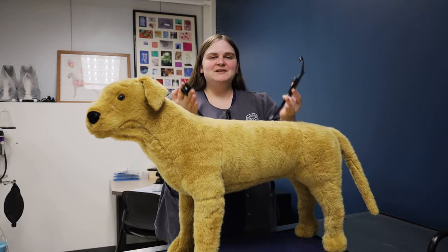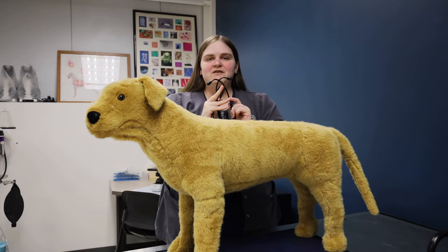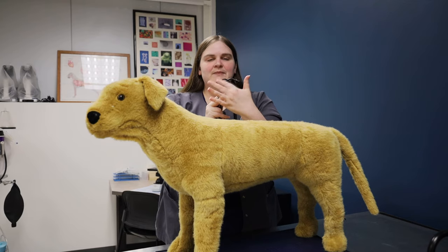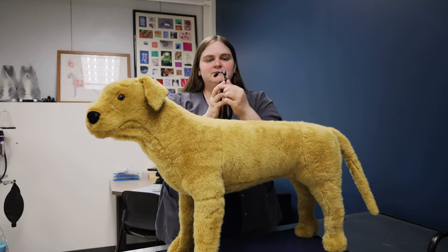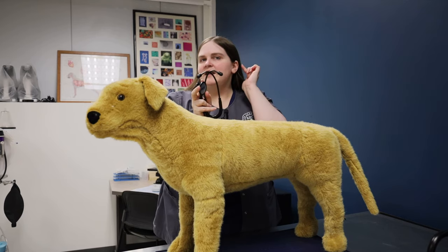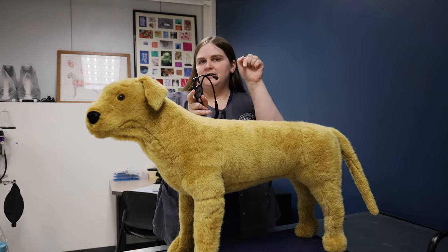Let's talk about how to use a stethoscope. First off, one of the biggest things is these earpieces. These earpieces slant slightly to one direction. We want to make sure those slant toward or forward into our ear canal.